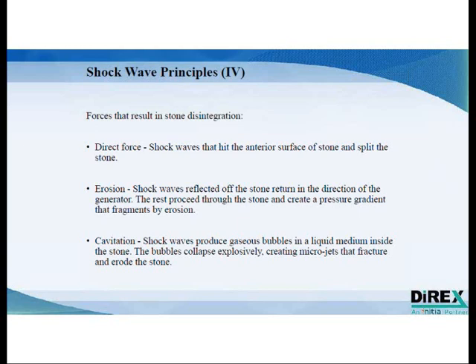There are three forces that cause the disintegration of stones. The first one is a direct force, the impact of the shockwave on the stone itself. The second one is erosion. You have shockwaves which are reflected off the surface of the stone and that head back towards the generator. And the rest of the wave is transmitted within the stone and then will bounce inside the stone from the interior wall to the exterior wall.